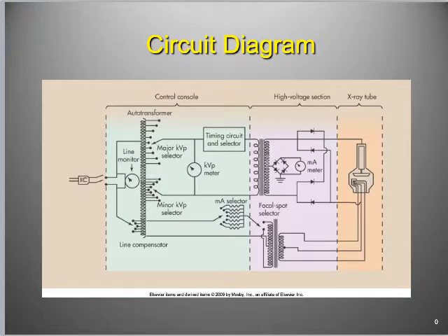All right. So the timing piece is controlling how long the anode is energized, and so that controls how long the electrons are jumping across the X-ray tube, right? So it's on that KVP side, the registry.